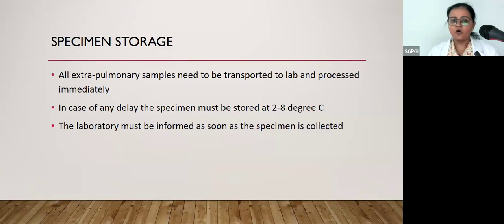Specimen storage. All extrapulmonary samples need to be transported to the lab and processed immediately. In case of any delay, the specimen must be stored at 2 to 8 degrees centigrade. The laboratory must be informed as soon as the specimen is collected.